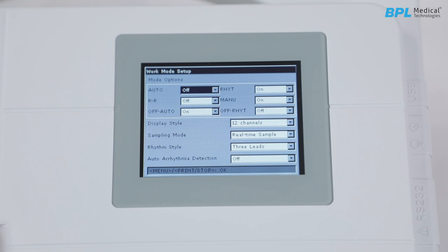Coming to the mode options: first is auto mode, the default and commonly used mode — 10-second ECG data can be sampled, analyzed and printed in this mode. Then is rhythm mode — rhythm lead ECG waveform of 1 or 3 leads can be sampled for a long time, mainly used to diagnose frequent arrhythmia. Then is RR mode. Next is manual mode, where sampling, filter and print time can be adjusted manually, and ECG data of arbitrary length can be sampled.